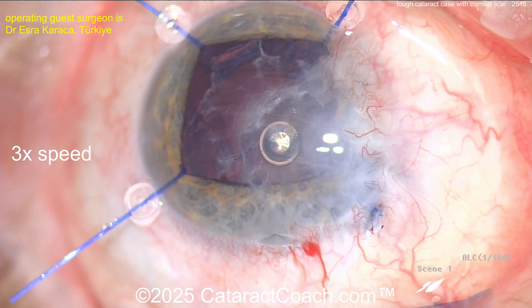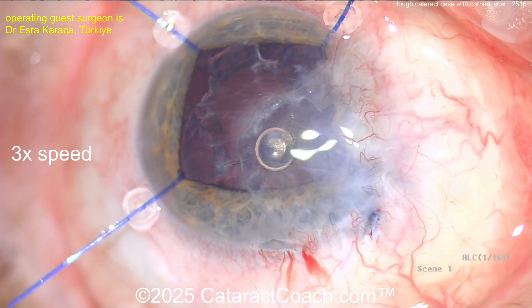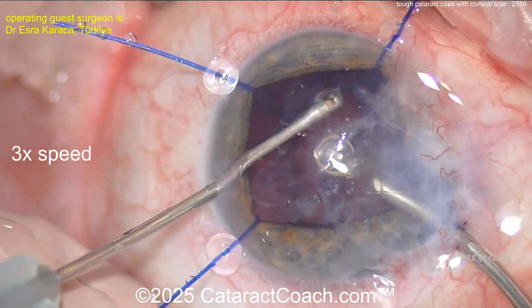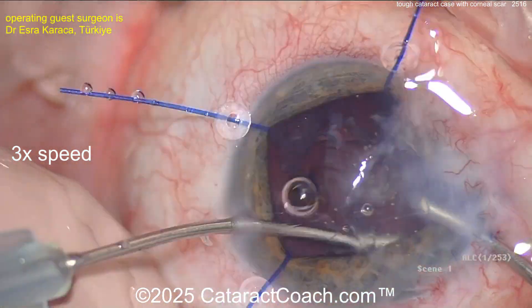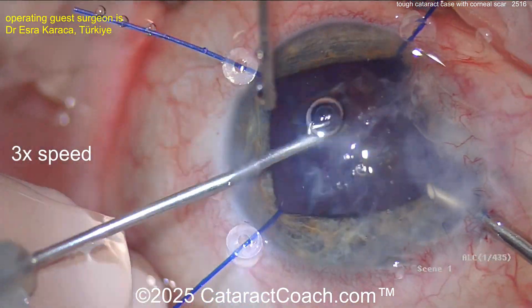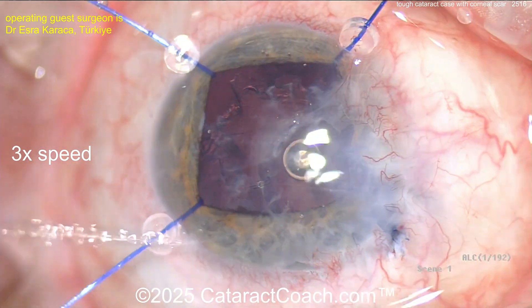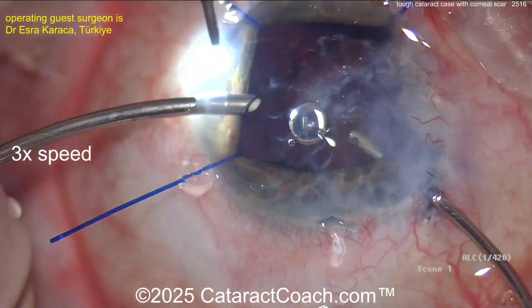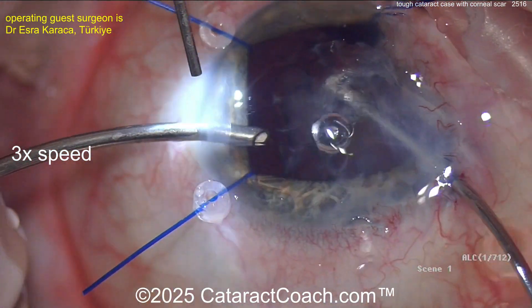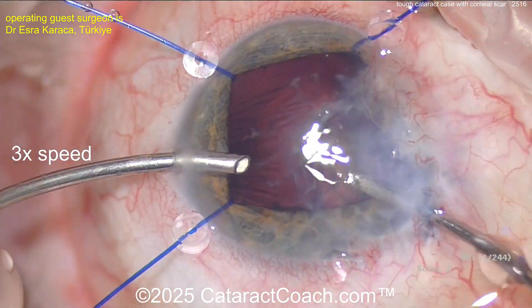For cortex removal, the light pipe can be helpful for that tangential lighting. A little more viscoelastic — you can viscodissect. A bimanual approach is also smart. For the lens power calculations, figure out what the average central corneal power is, calculate, and then add at least one to two diopters to the IOL power. Again, a little myopia is always your friend here. Now cleaning up the cortex.